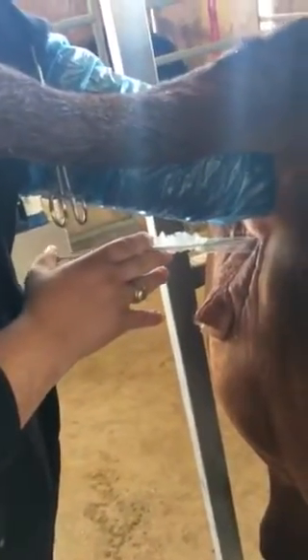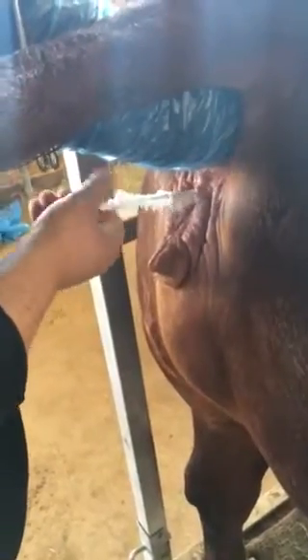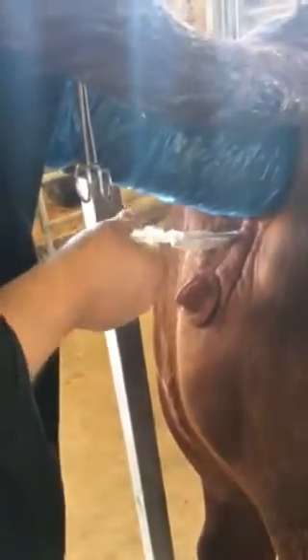Slowly I'm going to push in the — I'm going to back out just a little bit to make sure that I have it. Then I'm going to go in and I twist this gun. Not really for any reason other than the guy that trained me said to do that. It releases the semen, and I pull it out. And that's it. She's bred. Hopefully she takes.